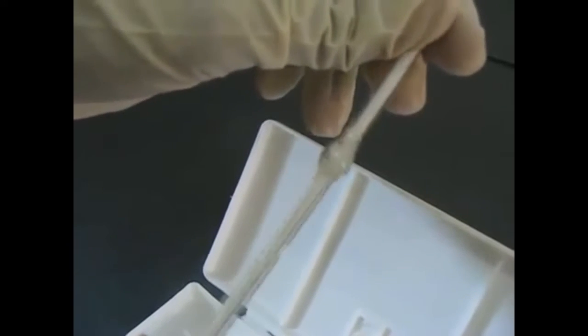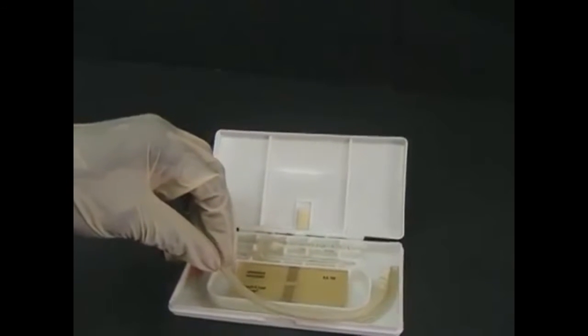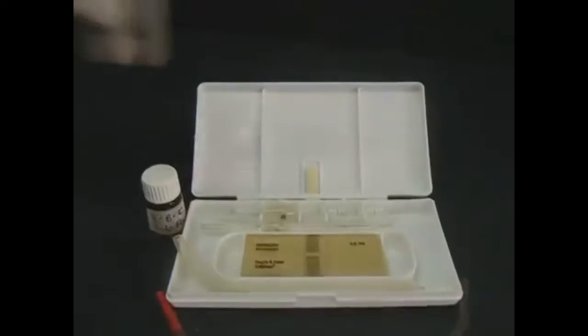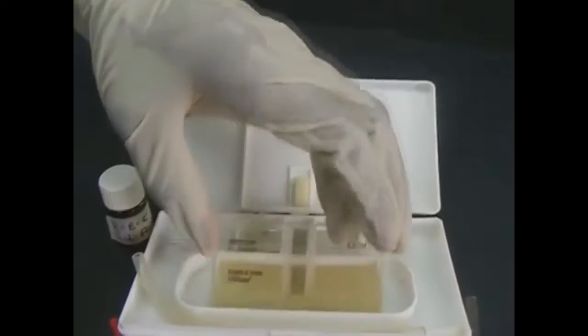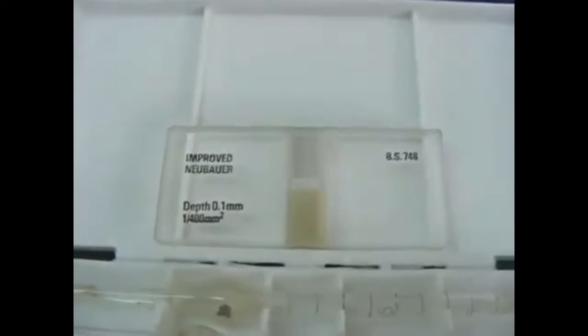A hemocytometer apparatus consists of a white blood cell pipette, a red blood cell pipette, a cover slip, plastic tube, and an improved Neubauer hemocytometer of depth 0.1 mm and area 1/400 mm squared.